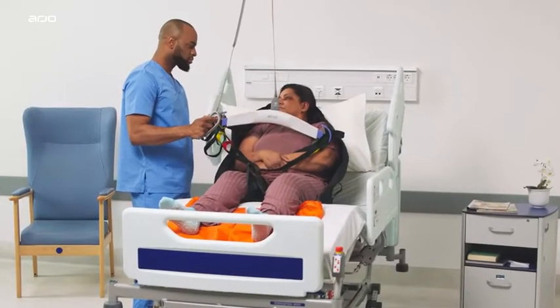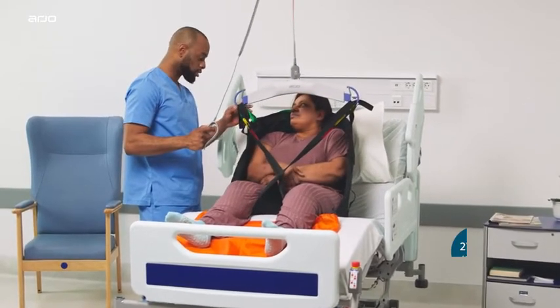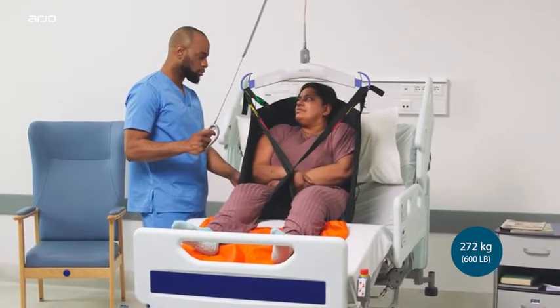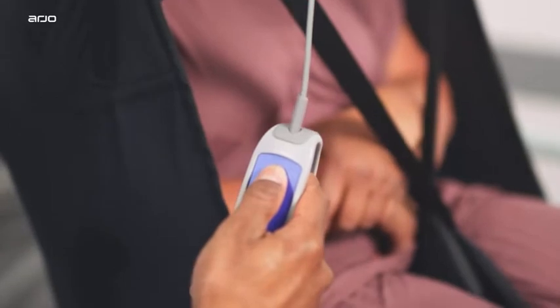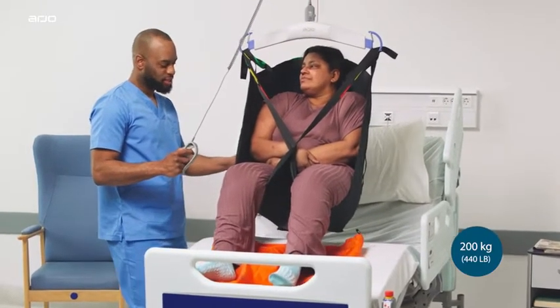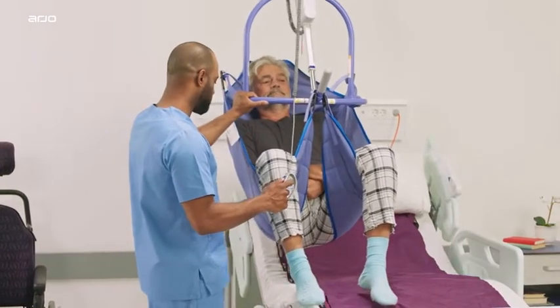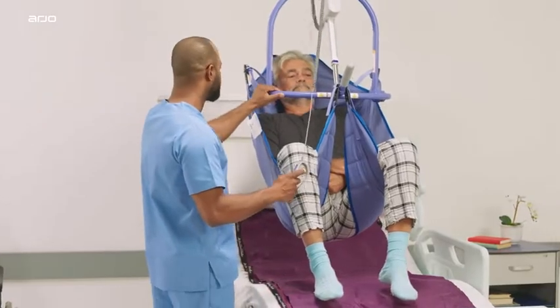The Maxi Sky 2 series of ceiling lifts have been designed with a maximum lifting capacity of 272 kilos, or 600 pounds. The safe working load can be lowered to 200 kilos, 440 pounds, or 120 kilos, 265 pounds, to accommodate lower capacity rail systems.